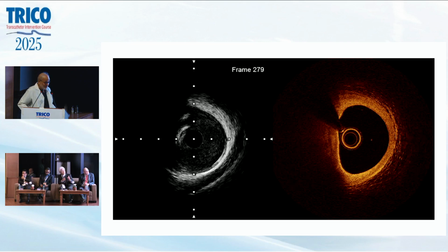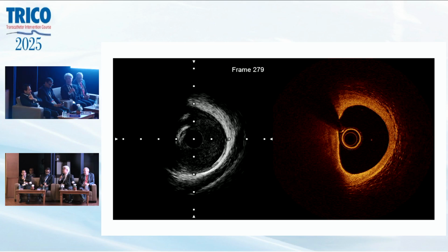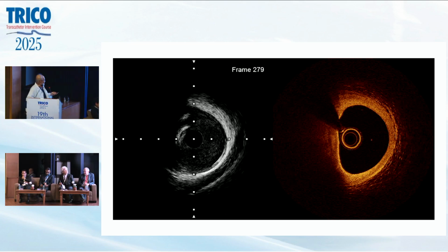Yeah, in my experience, that kind of intraplaque hemorrhage looks like this. Okay. So was vasa vasorum rupture leading to this type of picture? Okay.